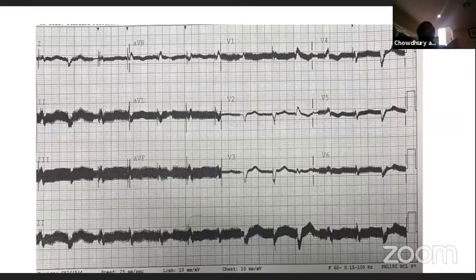So we are using the CVRX, a stimulator for cardiomyopathy. It's a neuromodulator. That gives you this kind of EKG, and a patient with a left ventricular assist device can also give you this EKG. This patient had a left ventricular assist device. I told the echo tech, you'll never get a better EKG, because I take the name of the patient away. We have a bunch of patients with the left ventricular assist device. I know the patient. I said, this is an LVAD patient. So I thought it is interesting to show you, because if you ever see this EKG, you can immediately figure it out.